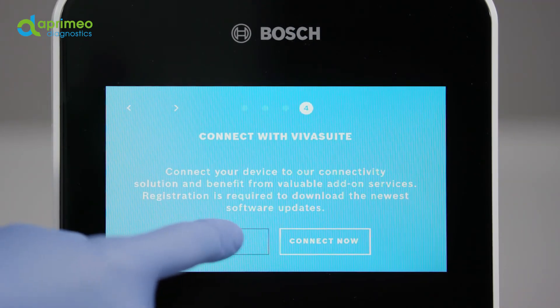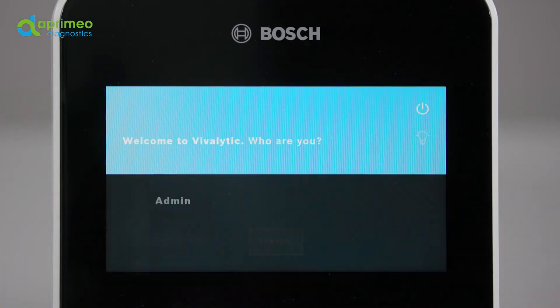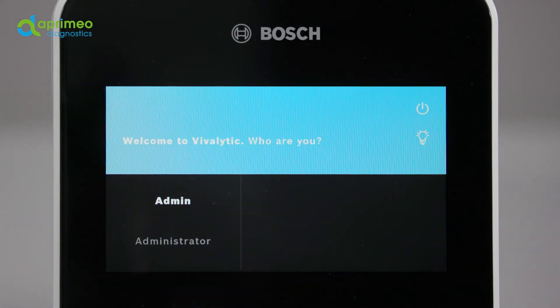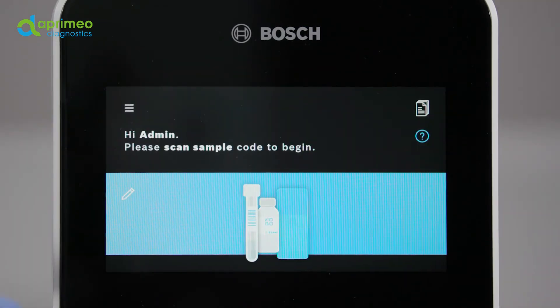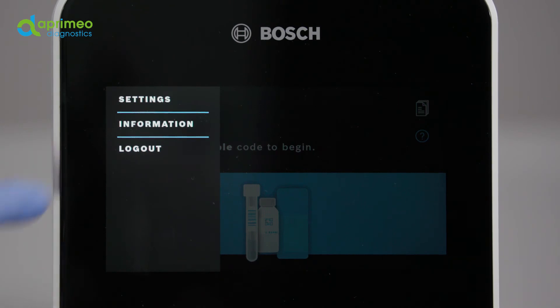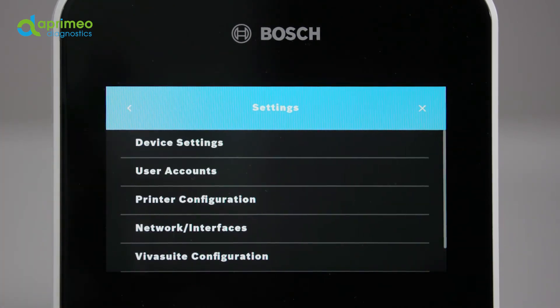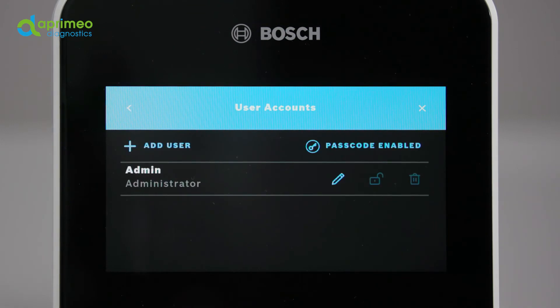As a matter of principle, the device can accommodate several users. In order to protect your patient data, we recommend setting up one personal password-protected account for each user. In order to create an additional user, open the menu, select Settings, followed by User Accounts. You will now see a list of the already created users.